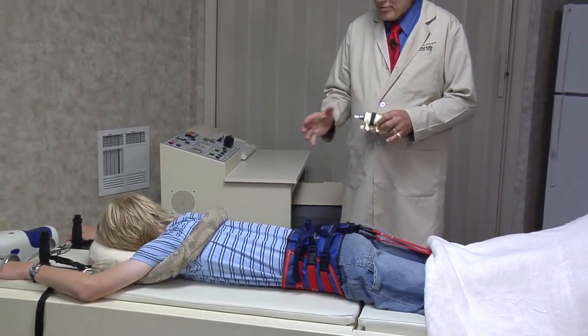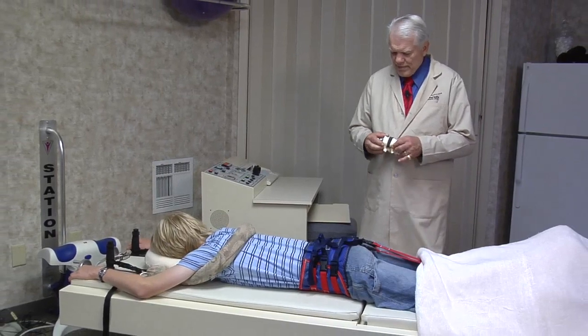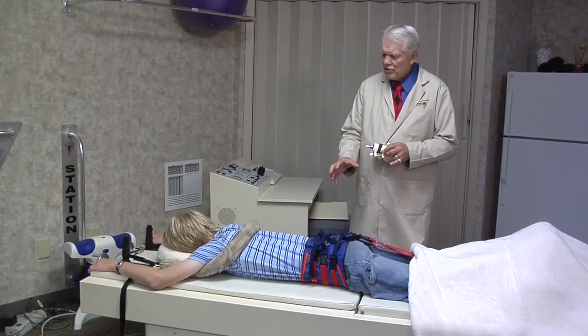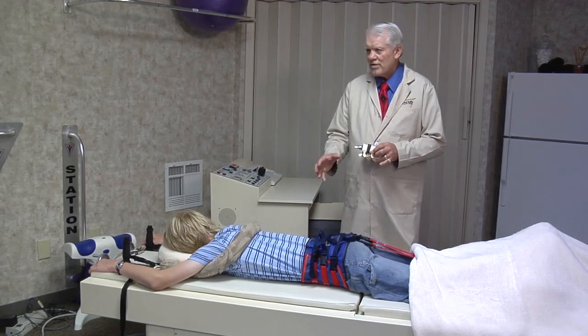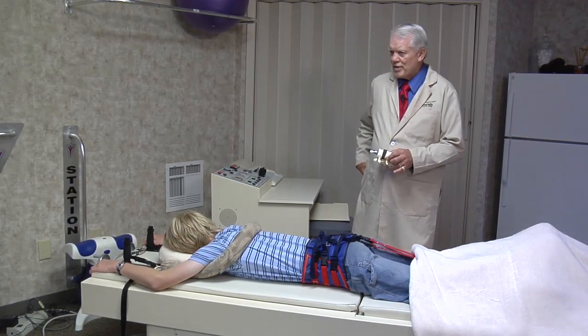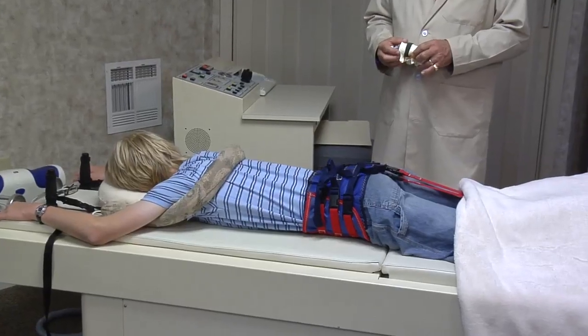It's very comfortable to the patient — very gently pulling the spine apart and isolating the area where the disc injury is. Usually during the course of treatment, somewhere a third into the program, you can just feel the scar tissue release the pressure on the sciatic nerve and it just lets go. You feel a warm feeling down the leg and the pressure starts to stay off that nerve as the disc starts to heal.